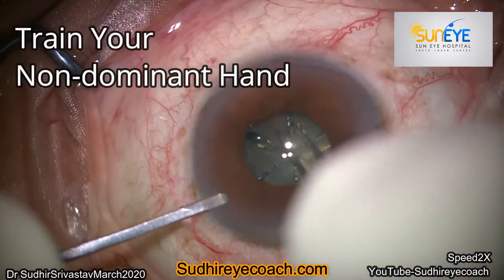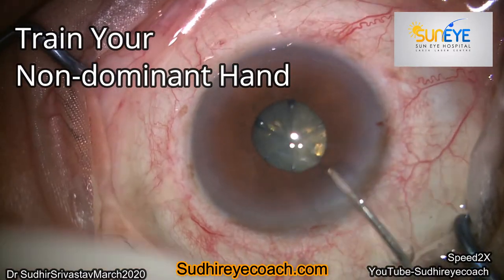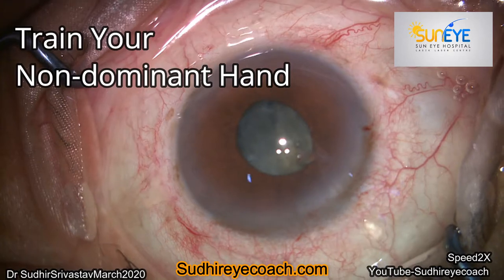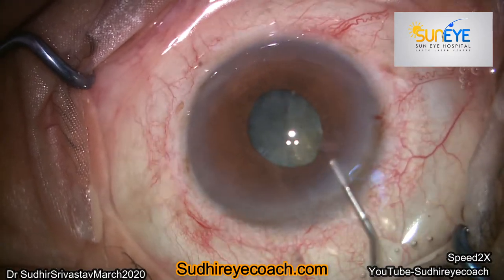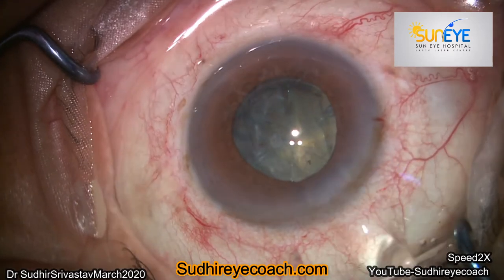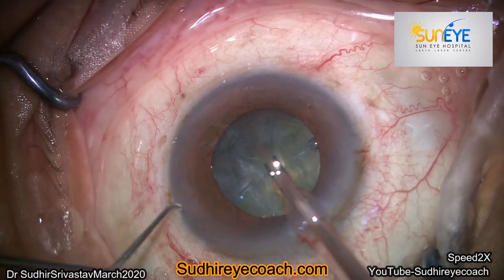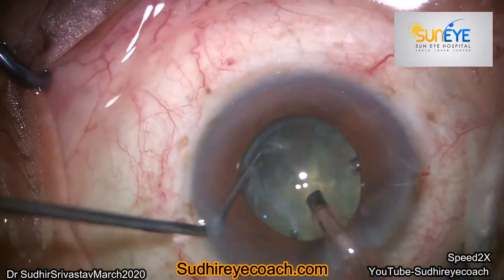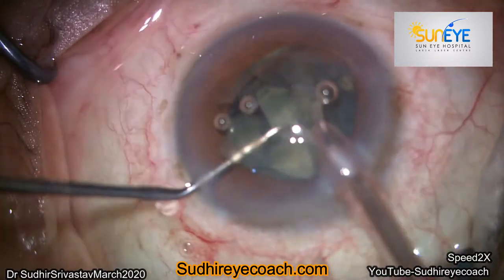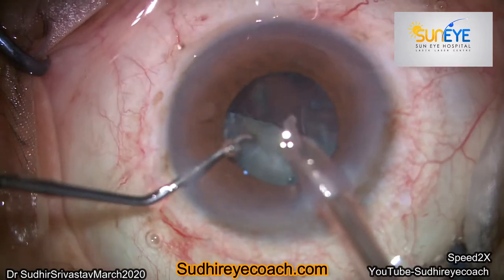Hello everyone. To become an accomplished phaco surgeon, a surgeon must develop and train coordination of both hands. For phaco surgery, we need to hold the phaco handpiece in one hand. If you are a right-handed person, then mostly we hold the phaco handpiece in the right hand, and we keep the left hand for manipulation through the chopper, Ziegler hook, or the manipulator.